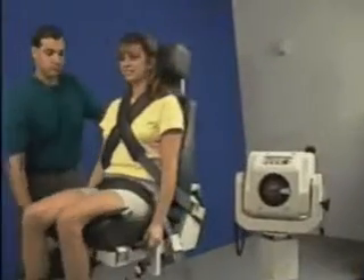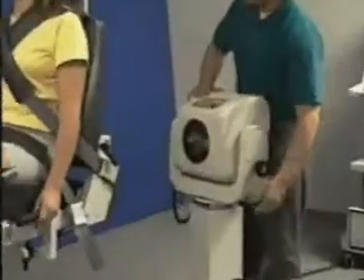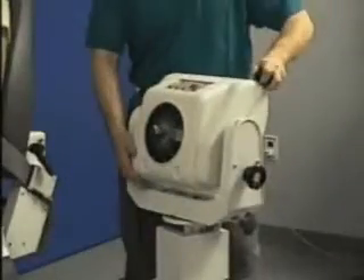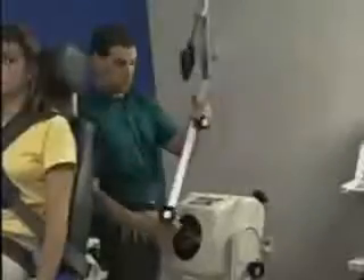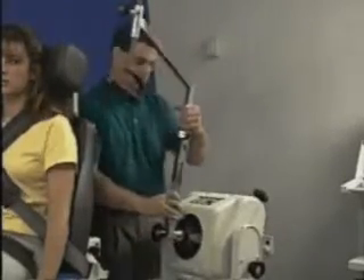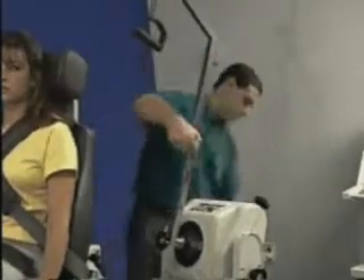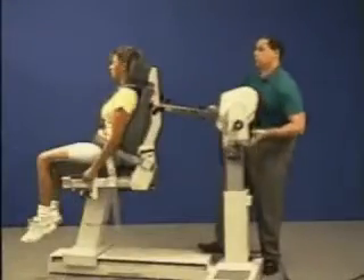Rotate chair to 75 degrees and dynamometer to 10 degrees. Tilt upward 10 degrees. Attach long shoulder attachment to dynamometer shaft, remembering to align the red dots. Adjust length of shoulder attachment to almost full extension. Raise dynamometer up.